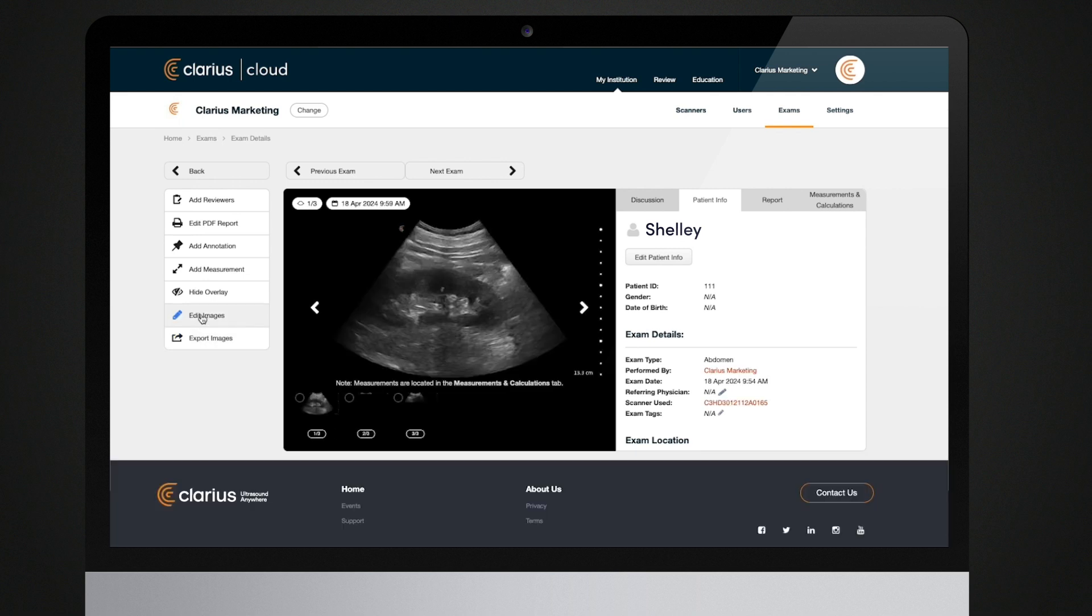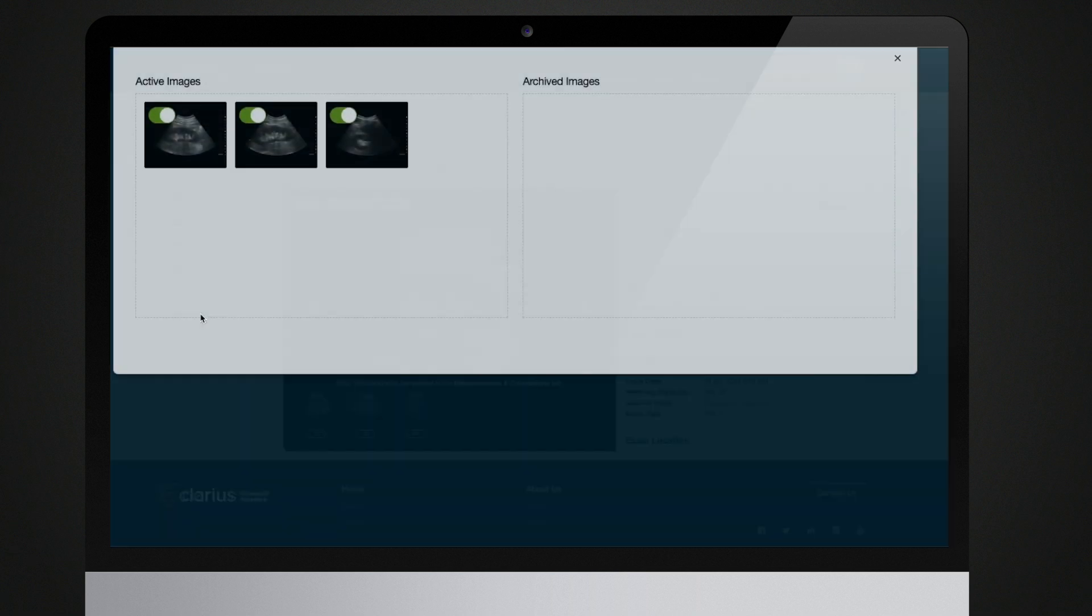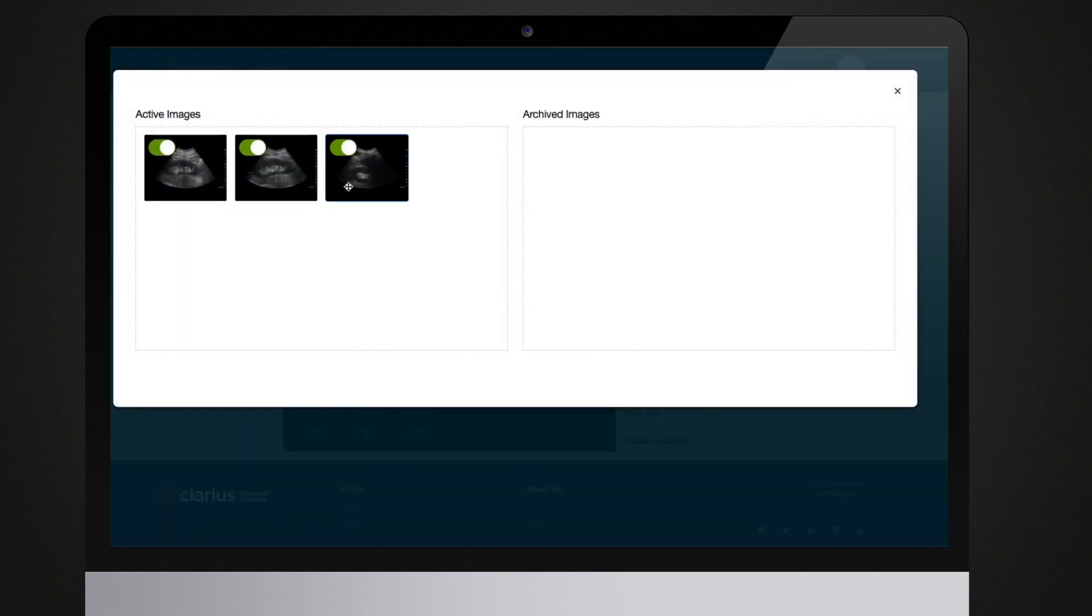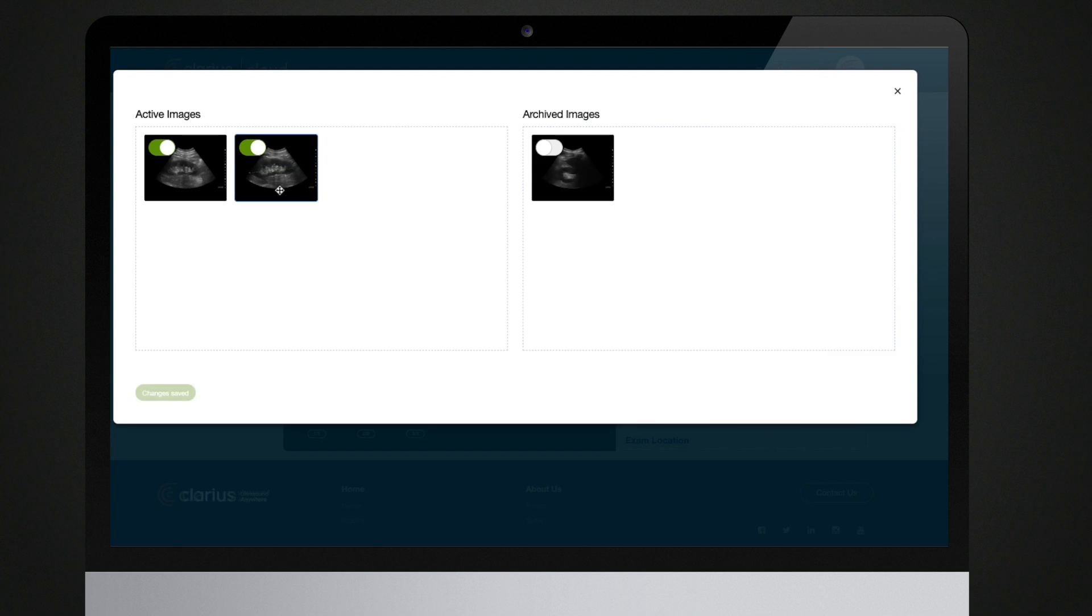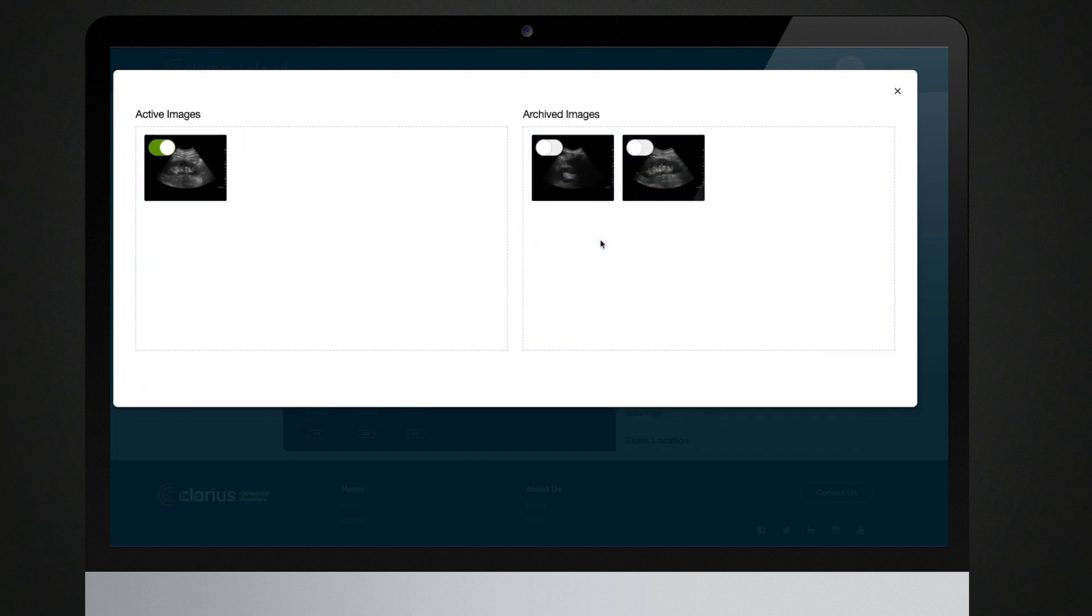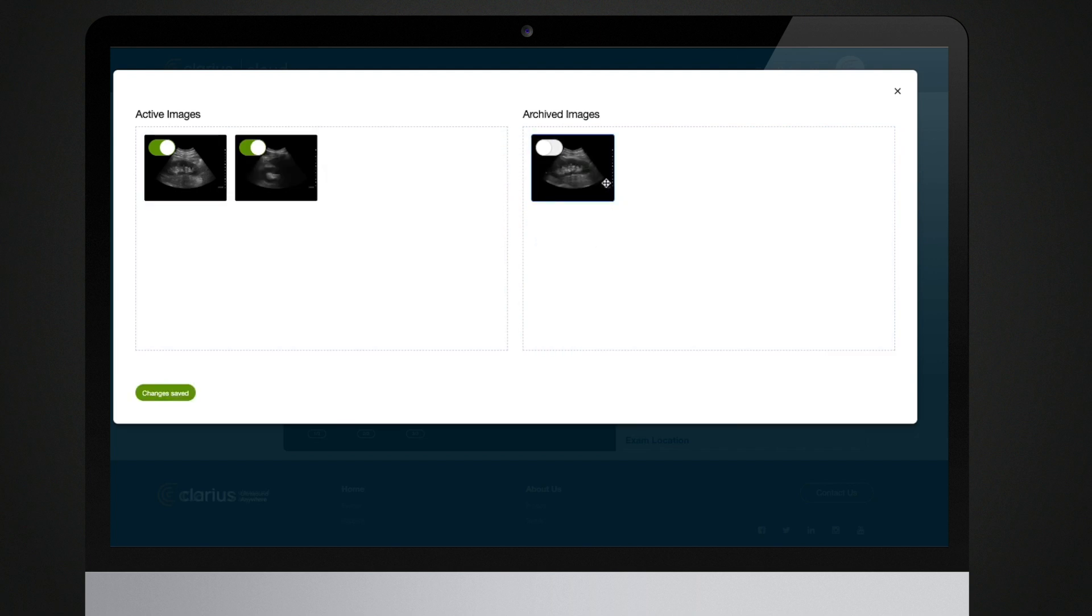You can also archive specific images within an exam by clicking Edit Images. Drag images between the active images and archived images columns to choose whether they will be displayed in the exam.